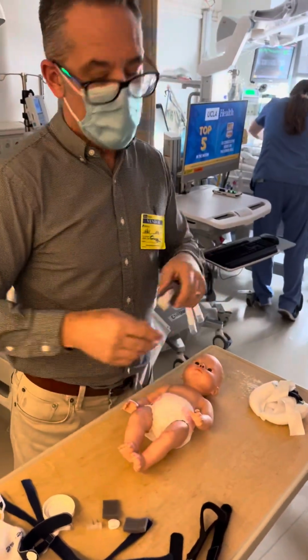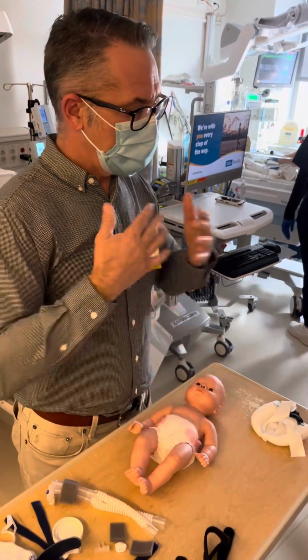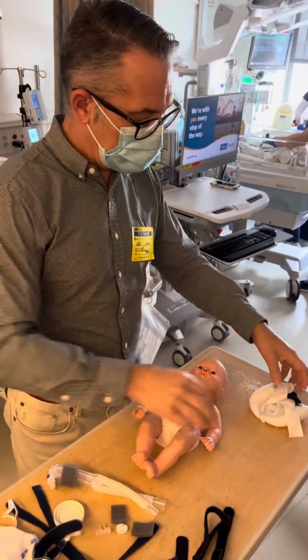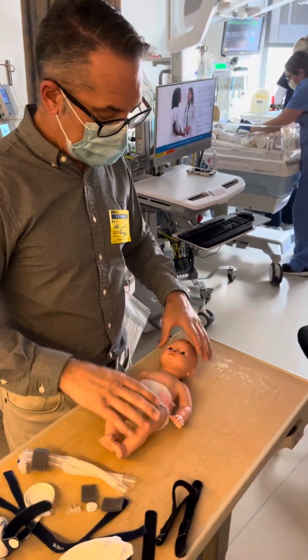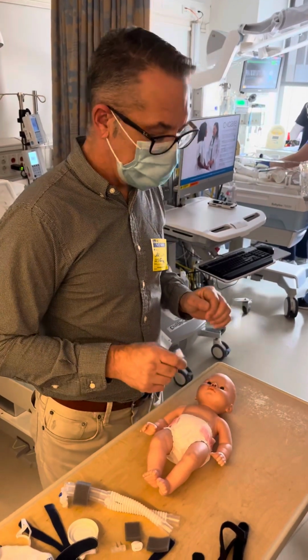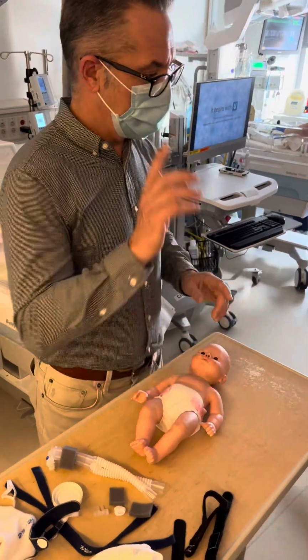Going to do is I'm going to create a scenario of what we consider ideal for setting up this interface. I'm going to play the role of the RT. You guys will be the RN. And when we set up our roles, everybody needs to stay in their lane. So the RT's goal is I want to get the interface on comfortably. And the RN's goal is to make sure the baby's not wiggling and the baby gets CPAP when it's time to do that.